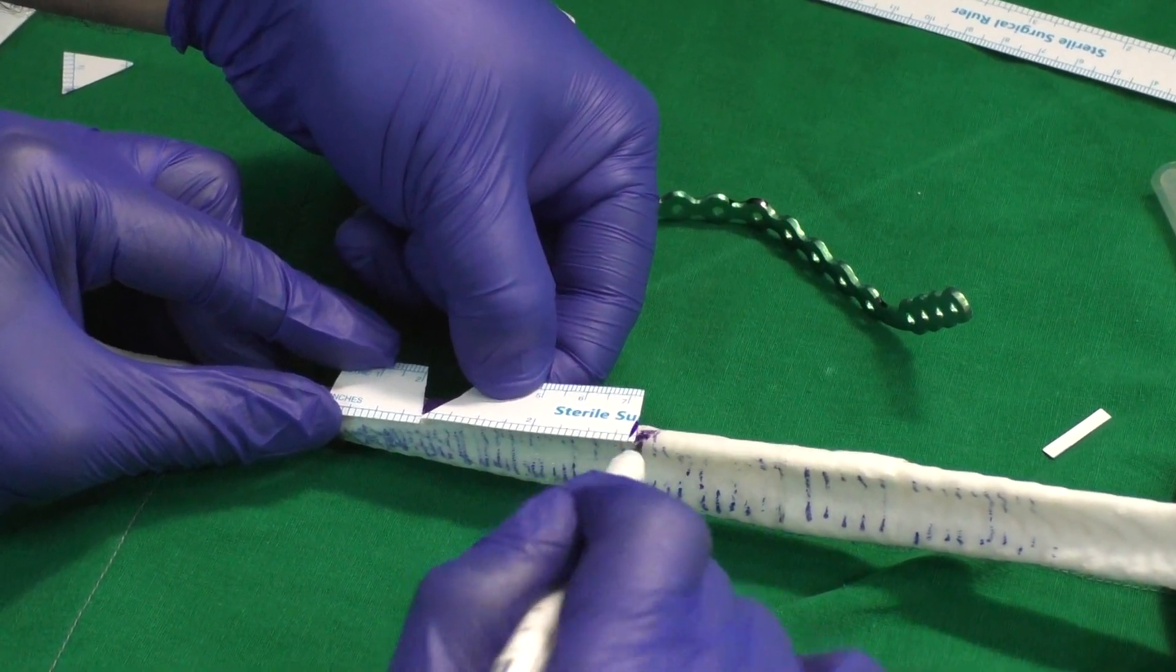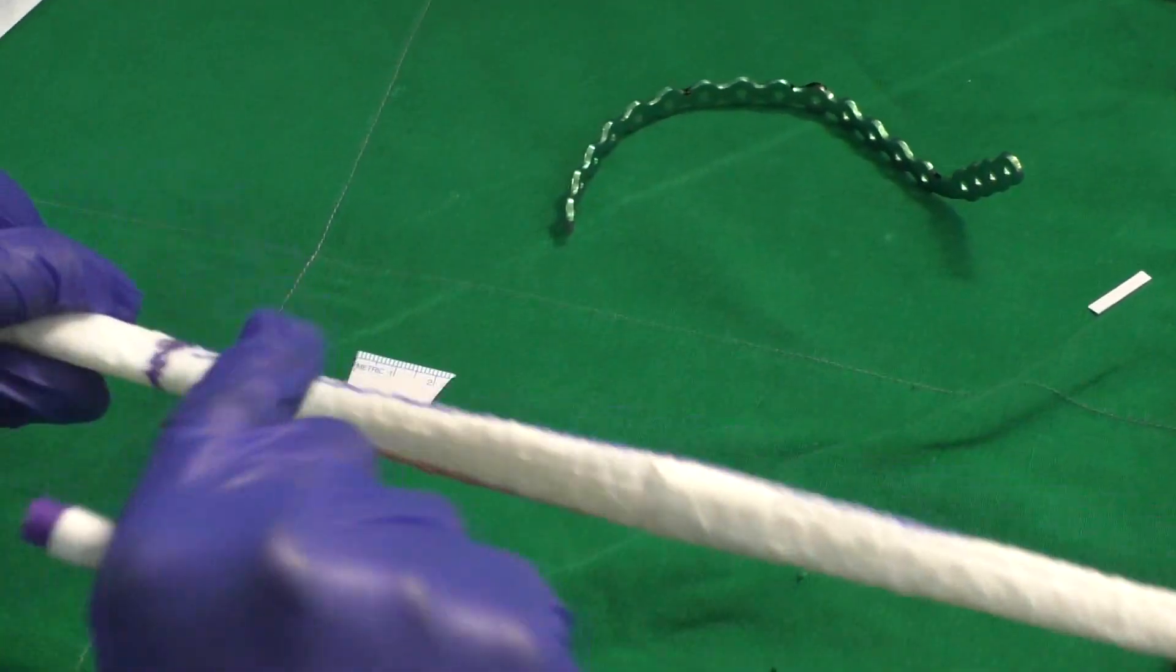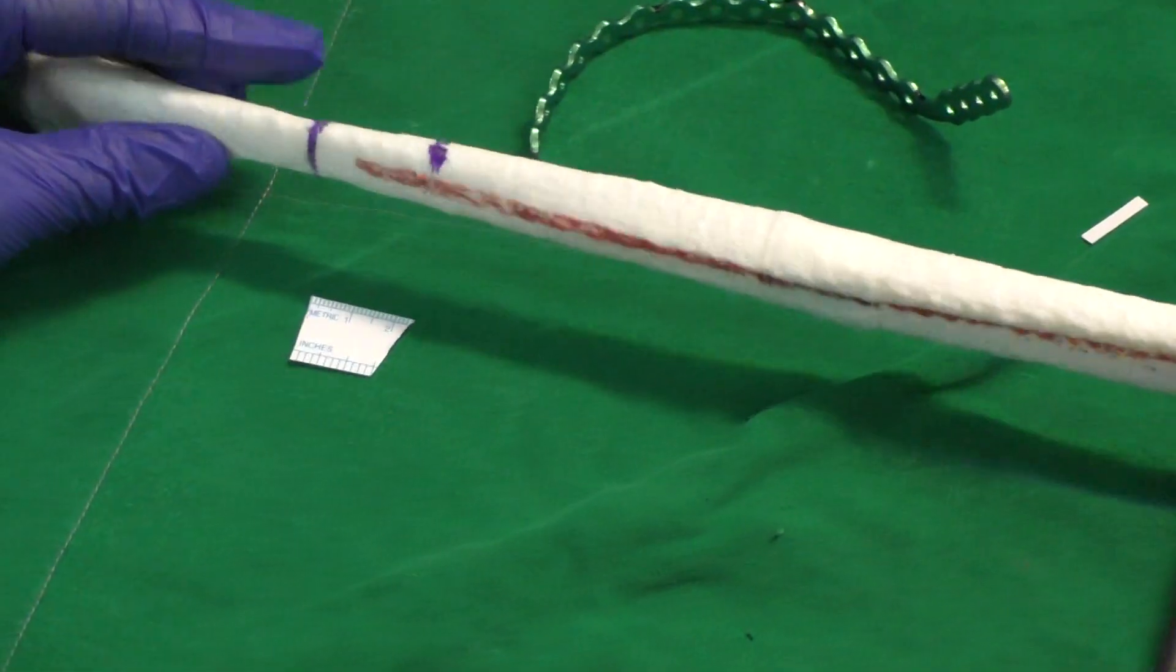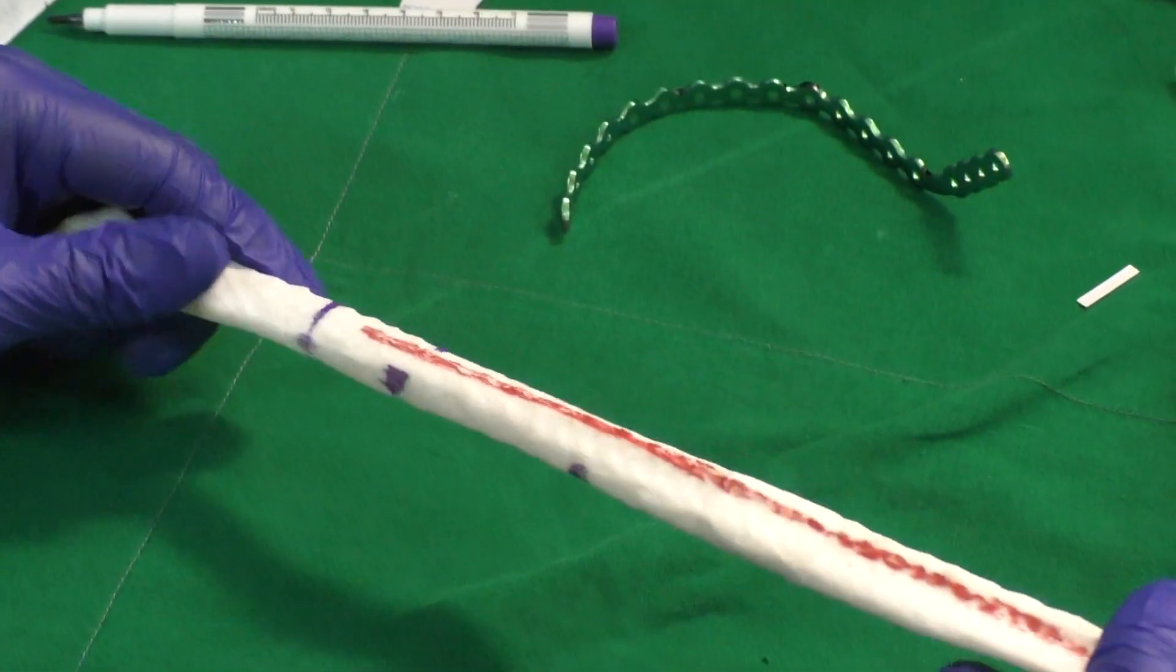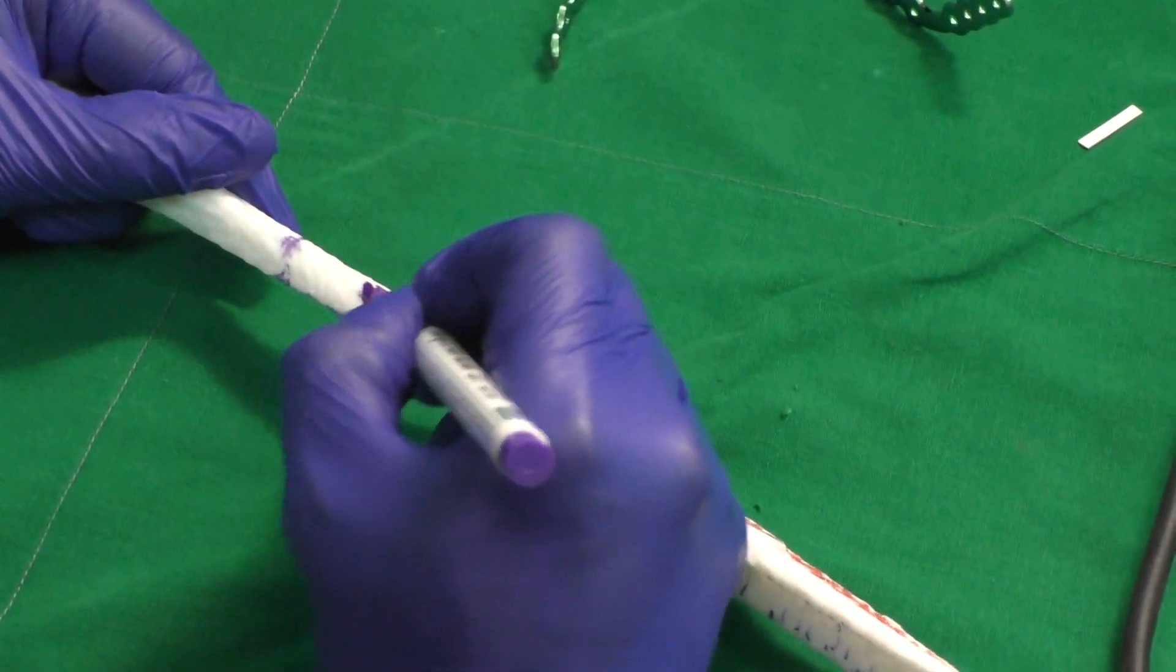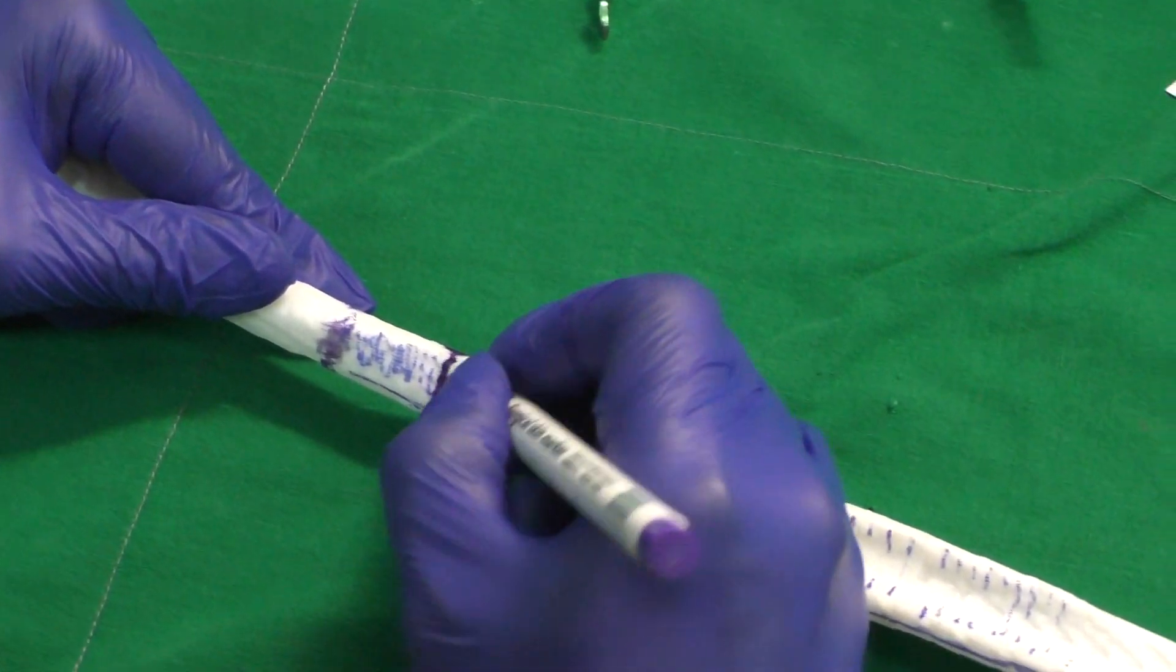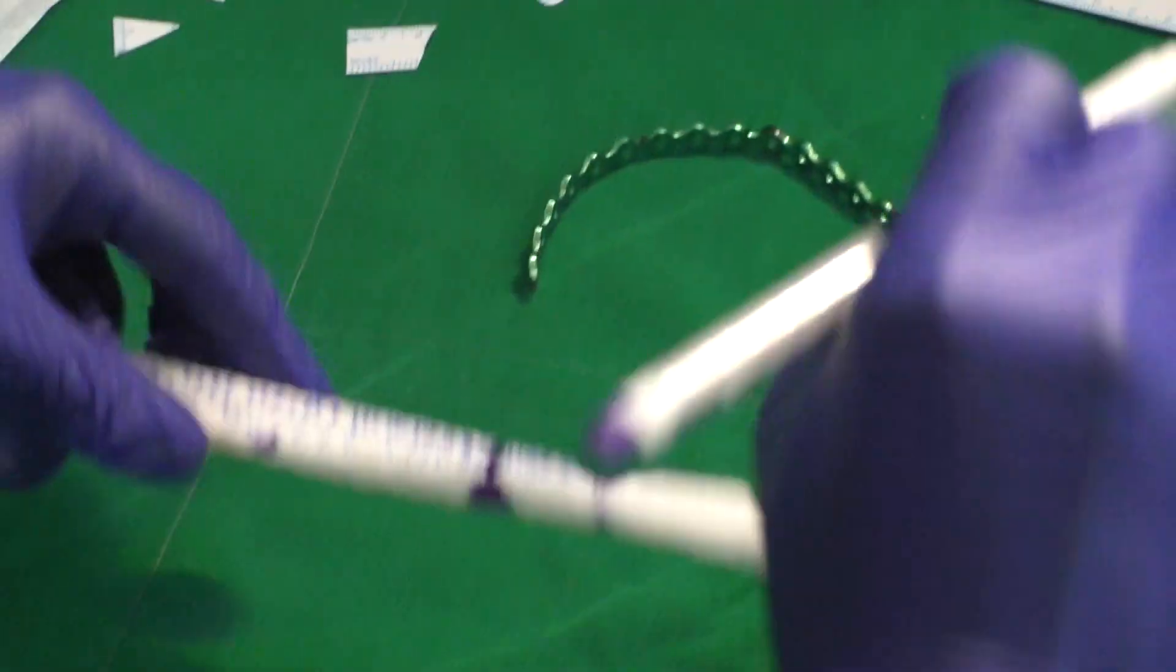Now the distal, the proximal osteotomy is marked once again. The direction of the osteotomy is confirmed once more, and this is the peroneal surface. Here I'm just reinforcing the markings of the osteotomy. The triangle is usually on the inferior border, but the apex is on the peroneal surface, and this is an important factor to consider.